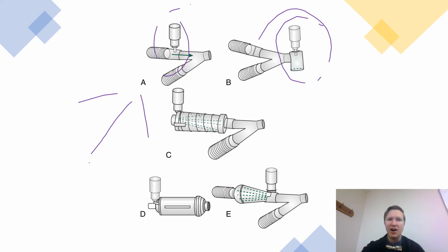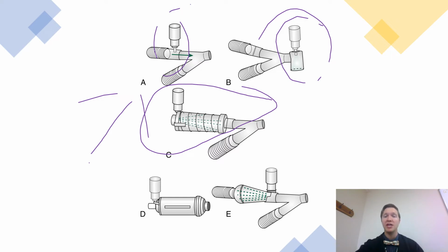Letter C here are these collapsible chamber devices. They're pretty nifty. I've never had to use one. The hospital I worked at never used these devices, but they seem pretty nifty to me. Your mileage may vary, so keep that in mind. My experience is not strong with this, but you would expand it for the medication delivery, and then it would accordion in and collapse when not in use. Therefore, you wouldn't have to worry as much about the compressibility factor compared to letter E.